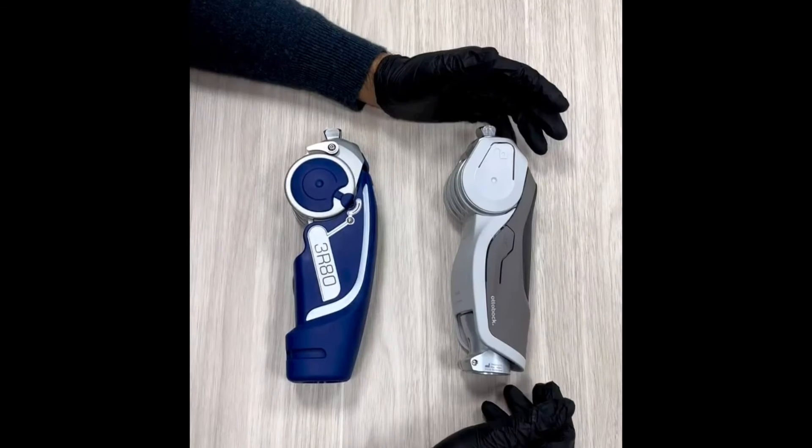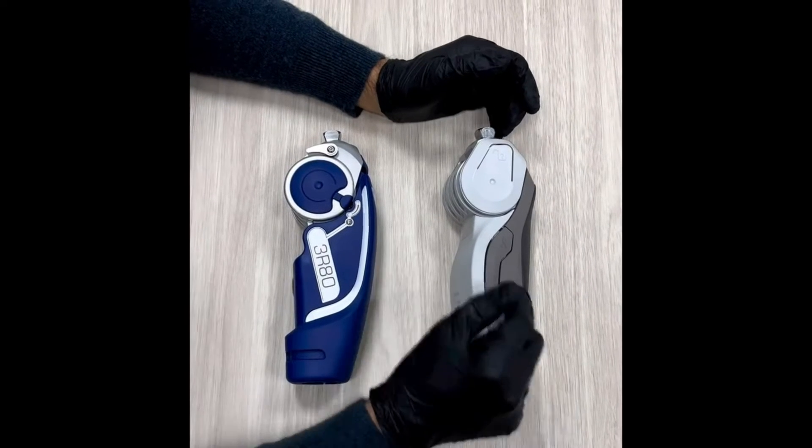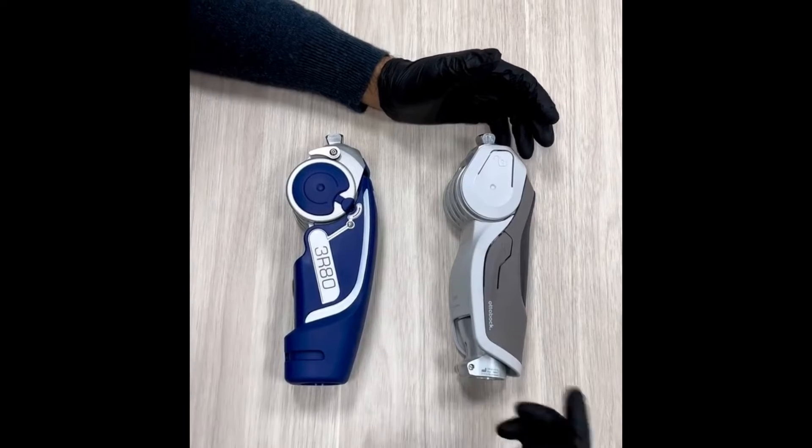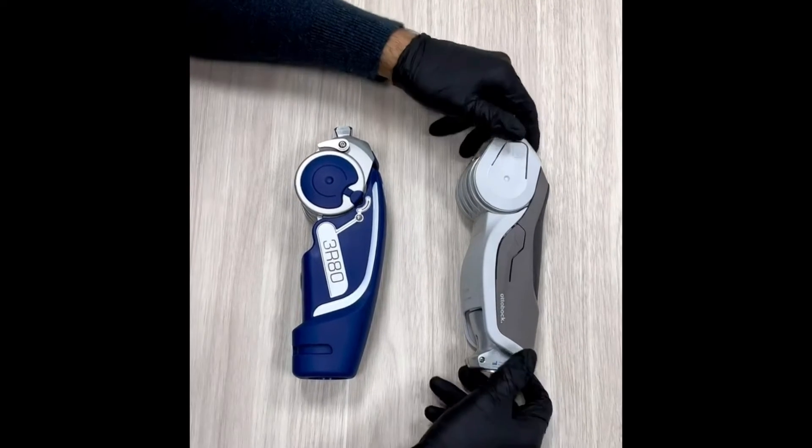An extension assist spring supports the swing phase by generating an extension moment. The additional spring included in the scope of delivery can be installed to increase the extension moment.